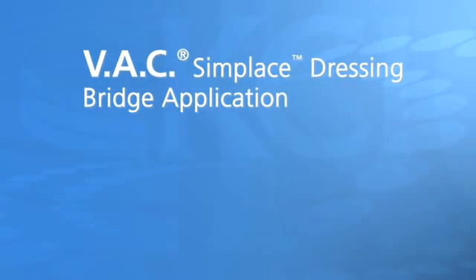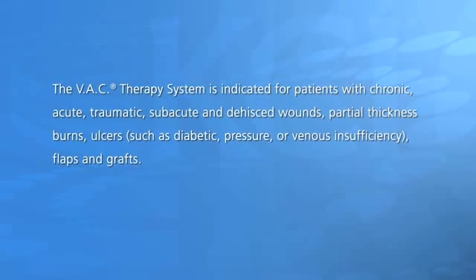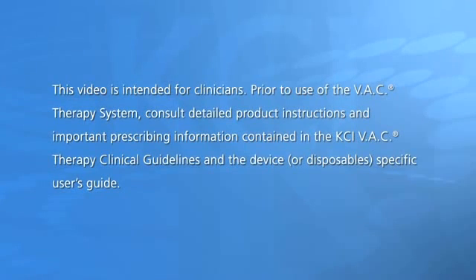KCI VAC Simplace Dressing Bridge Application. The VAC therapy system is indicated for patients with chronic, acute, traumatic, subacute, and dehisced wounds, partial thickness burns, ulcers such as diabetic, pressure or venous insufficiency, flaps, and grafts. This video is intended for clinicians.